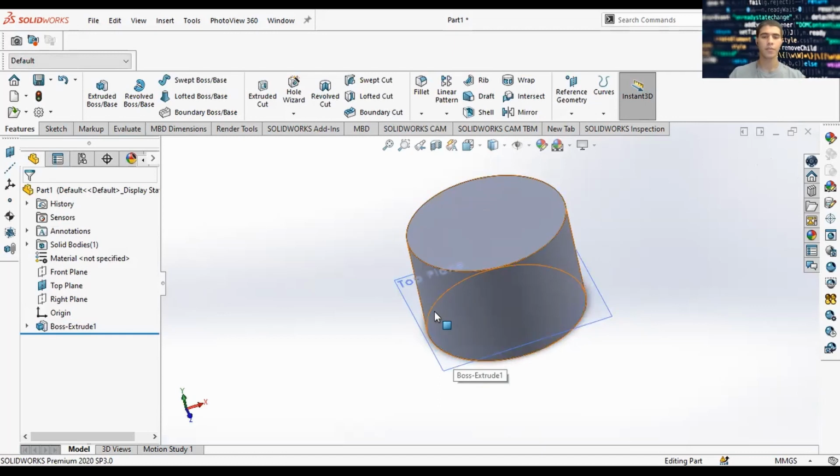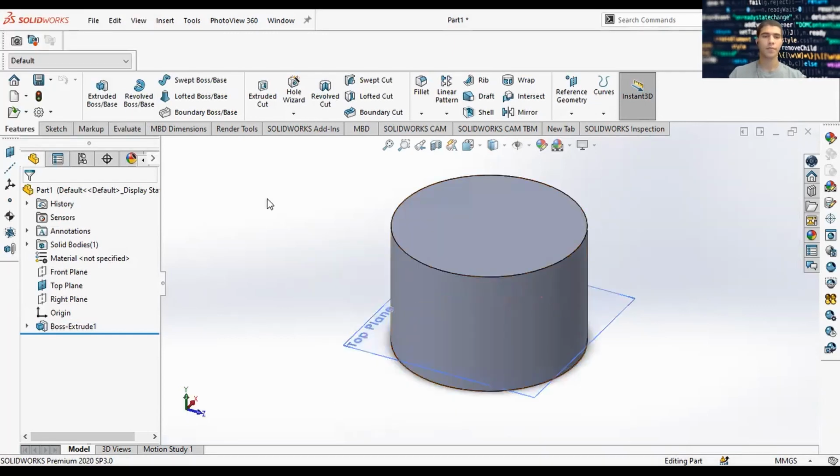The next thing you want to do is you want to be able to simulate that scallop feature. And so there's a nice function in SolidWorks called the curve function, or the equation-driven curve. And so the equation-driven curve is going to allow you to write a mathematical equation and then make a curve out of it. So let's go ahead and do that.